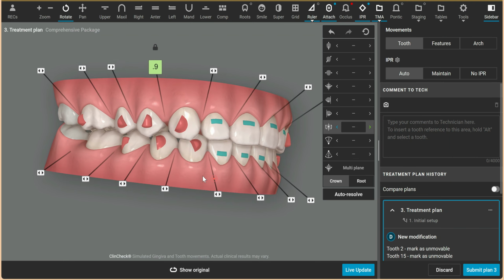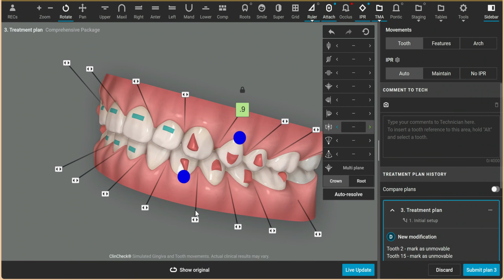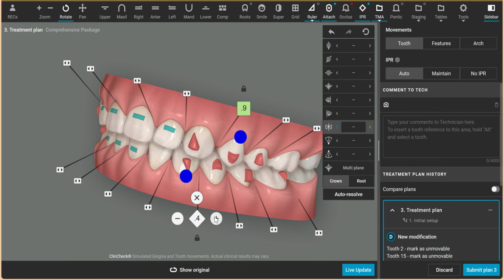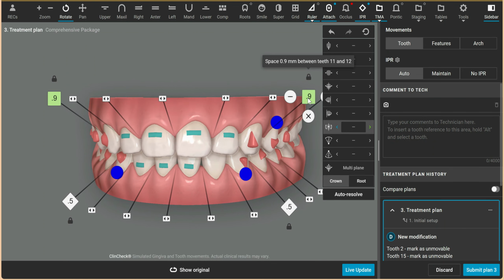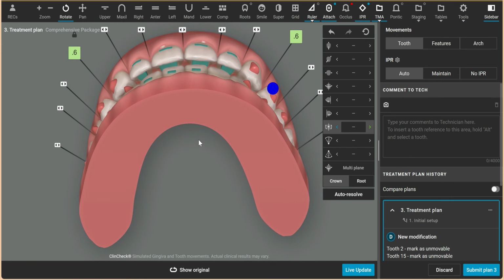I would leave that space, and if you want to get a little more, you could just add a little IPR distal to the lower cuspid teeth, like right here. This is how you add IPR. A 0.5 millimeter increment of IPR distal to the lower cuspid teeth gives you pretty significant bite relief. And now you can see there's even more. So in cases like this, I'll usually add spacing. Maybe you want to back down the spacing a little bit because you added that IPR. You can just do this with the 3D controls, and then you can look at the result right away.